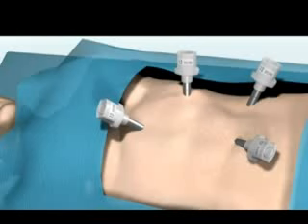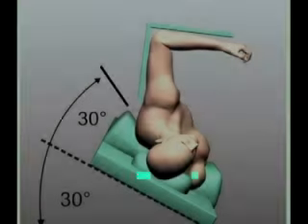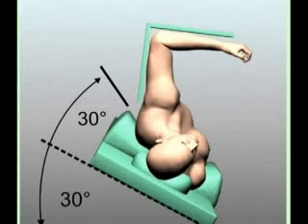These trocars are going to be placed with the patient in the 60-degree elevated position, the affected side elevated above. For the entire procedure, the patient is placed in the 60-degree elevated position, the affected side up. The ipsilateral arm is lifted in a hanger, whereas the contralateral arm is padded, closed and extended to the body of the patient. We demonstrate the insertion of the last trocar under visual control.